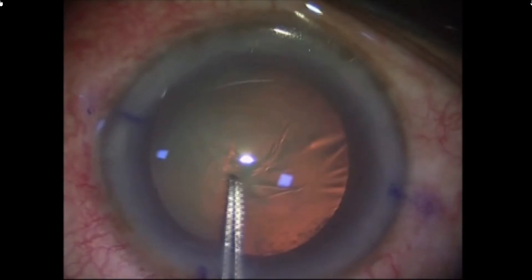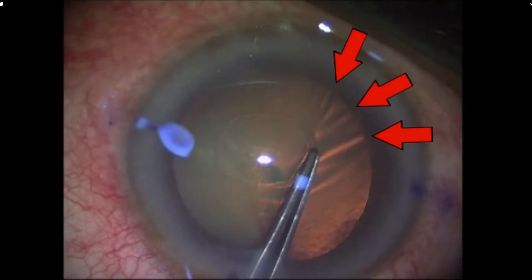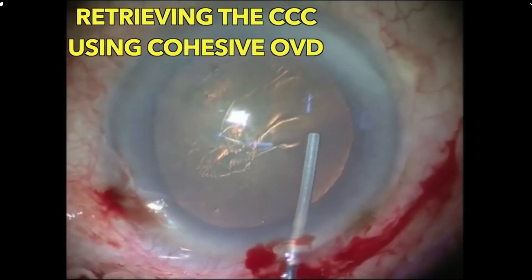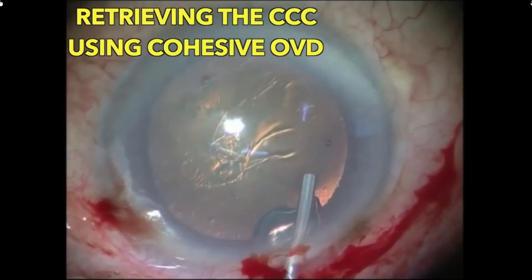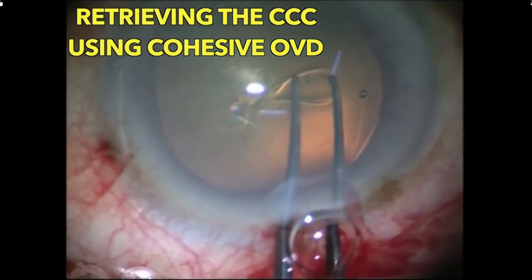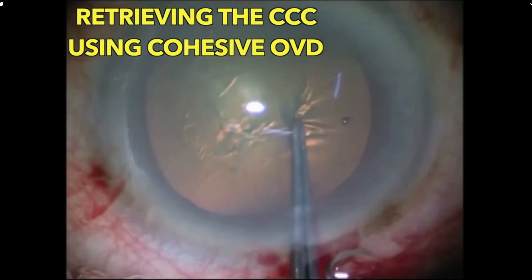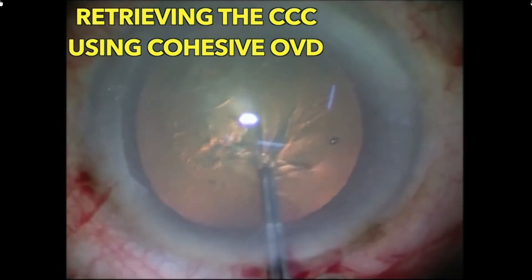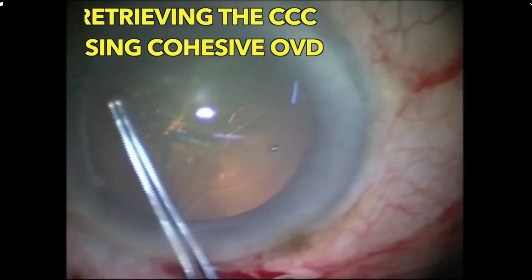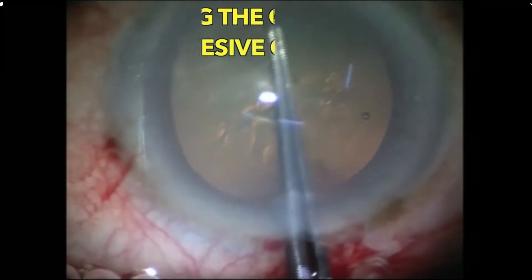The anterior capsule will show the wrinkles, and she will try hard to extend and just run off. If you're not careful, she will desert you, and to the equator she will quickly take off.